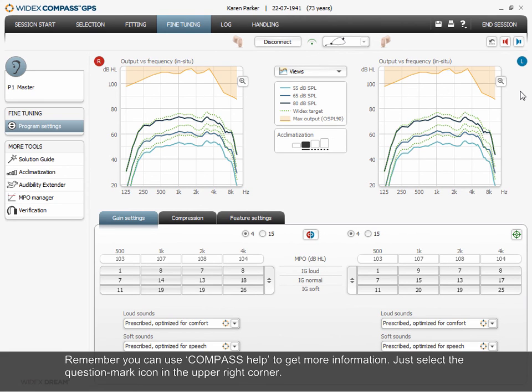Remember, you can use Compass Help to get more information. Just select the question mark icon in the upper right corner.